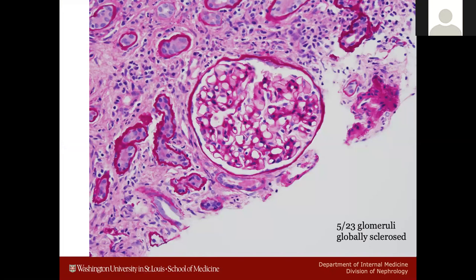Here's one of the glomeruli on high-power PAS stain. The basement membrane looks okay, the mesangium looks okay, and the capillary loops look open. But going toward the interstitium, there are a bunch of cells in there and all the tubules — as we saw on low power — are spread apart with closed-looking lumens. There's space within the interstitium and a cellular infiltrate.